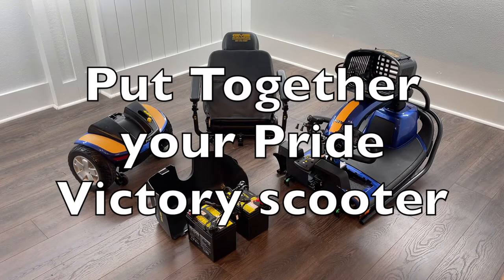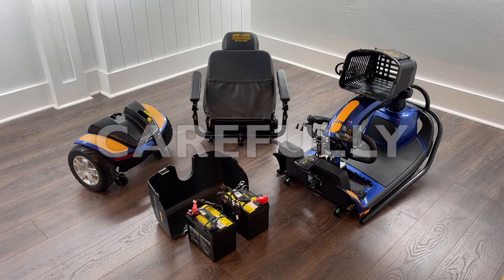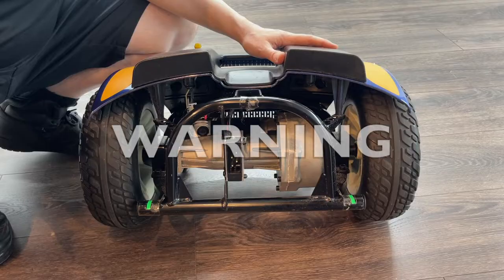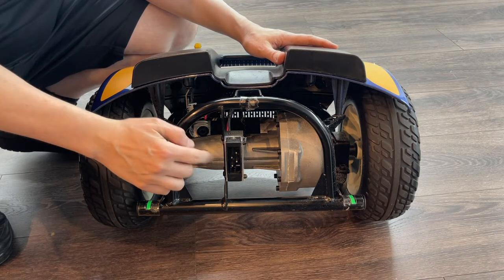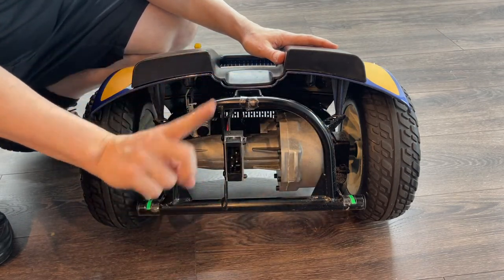Let's carefully put together your Pride Victory Mobility Scooter in four steps. Key word: carefully. Warning — if you damage these pins, you will kill your scooter, and it cannot be fixed.